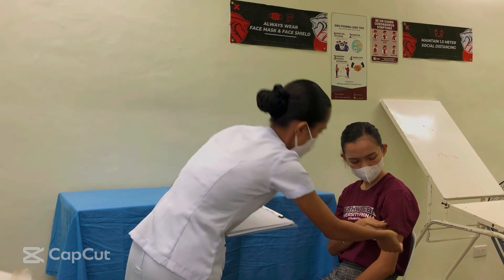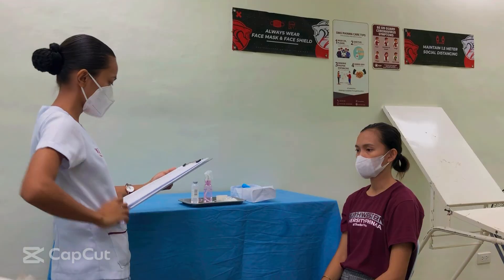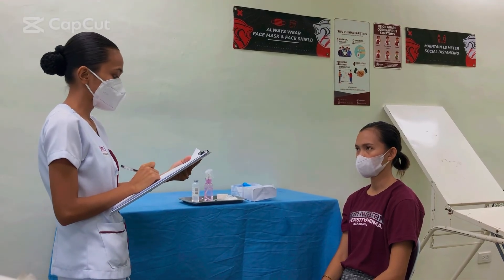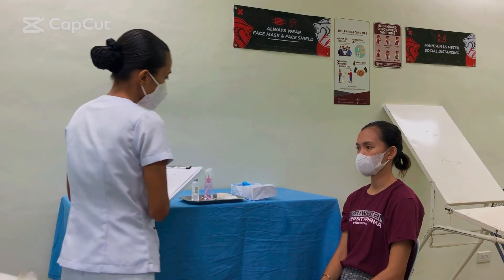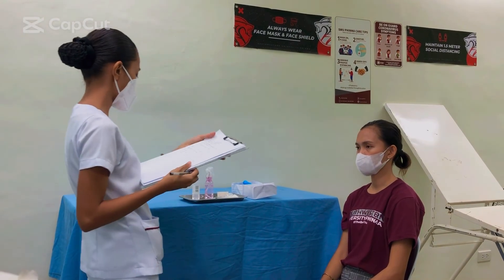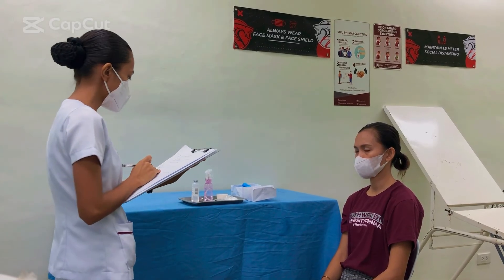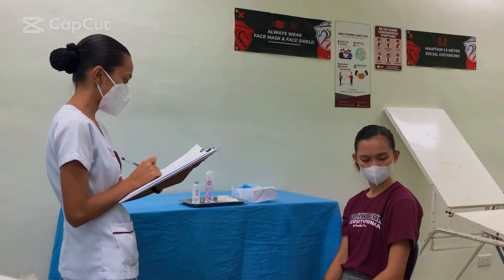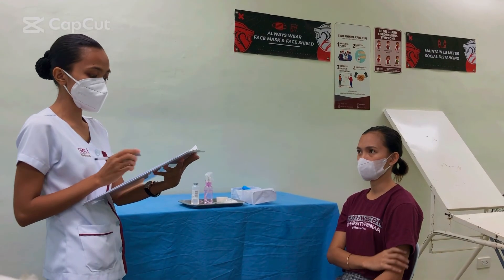Inspect the site, noting any bruising or induration. Document bruising or induration if present. There are no bruising or induration present. Chart the medication dose, route, site, time, and date given on the medication administration record immediately after giving the medication.